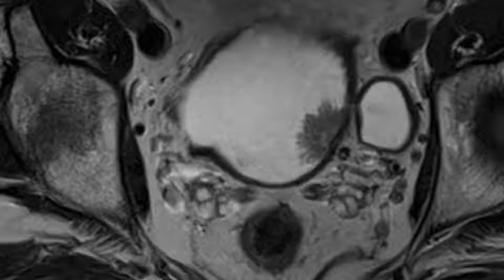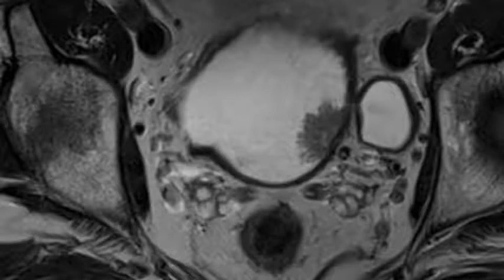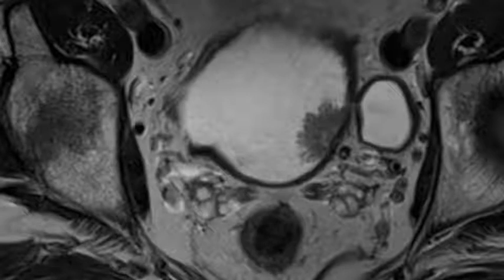Preliminary localizer sequences are used to evaluate for appropriate coil placement and bladder distension. A 28 to 32 cm axial FOV is usually sufficient to evaluate the bladder and surrounding soft tissue structures. Optimizing echo time, usually 60 to 80 milliseconds, is crucial for achieving a high contrast to noise ratio, which is important in assessing the depth of bladder wall involvement.